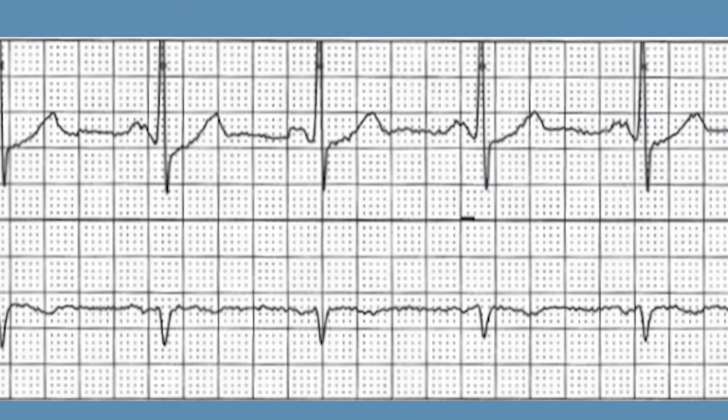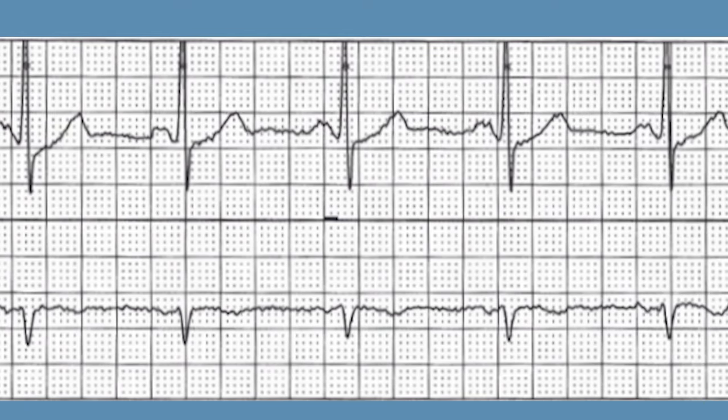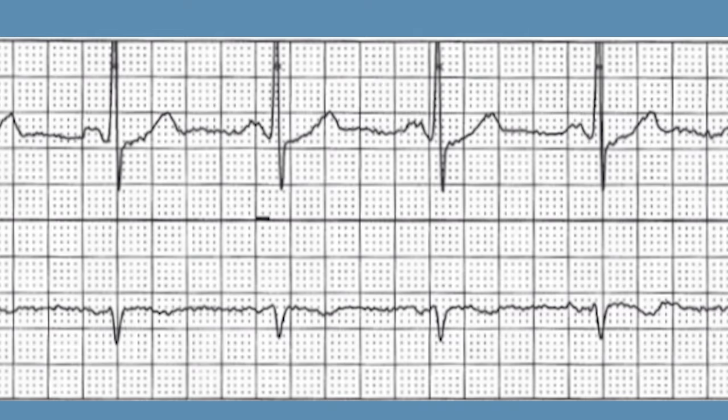Another more accurate way is to count the number of small boxes between two QRS complexes, then count the number between the next two, and the next two. If you're within one to two boxes on every single one — say 20, 21, 20, 20 — that's regular. But if you've got 20, then 38, then 22, then 42, that's a problem — that means it's irregular. Normal sinus rhythm will be regular.